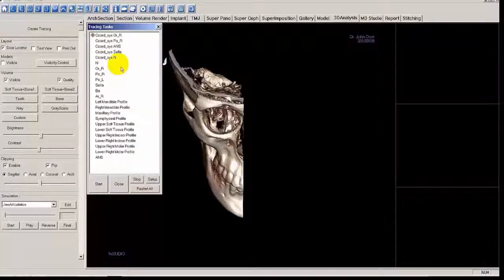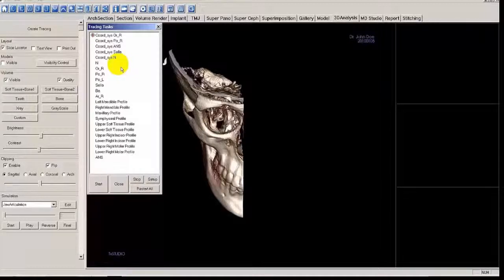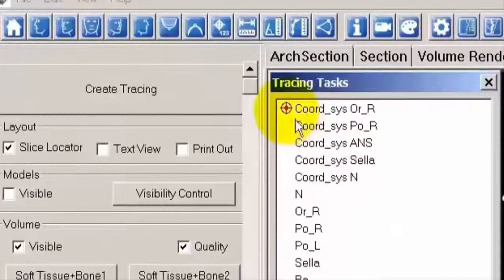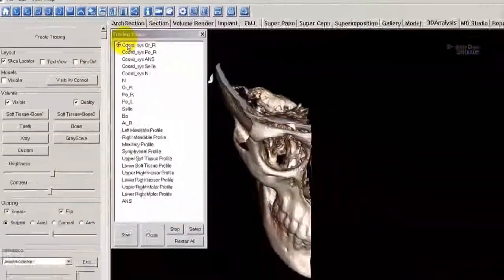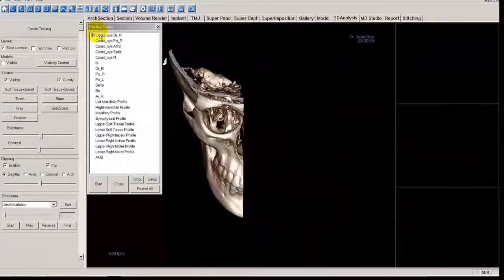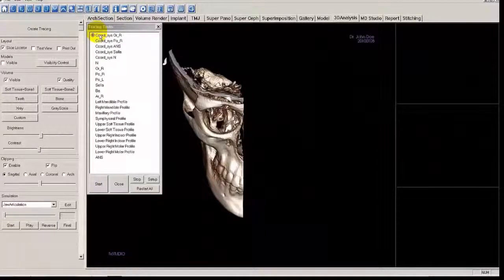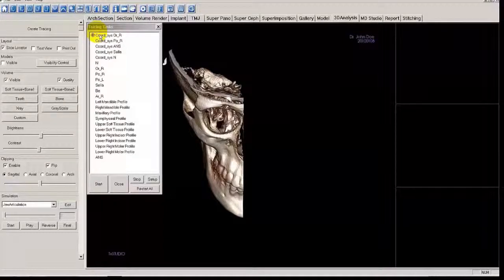Now, the volume has been clipped to afford a better view state for creating the selected landmark. You'll notice there is a crosshair to the left of the active task. When the task is completed, this crosshair will be replaced with a check mark. The default view was created with a particular scan when the software engineers designed this module. Depending on your scan, head positioning, and anatomy, you may have to adjust the view.